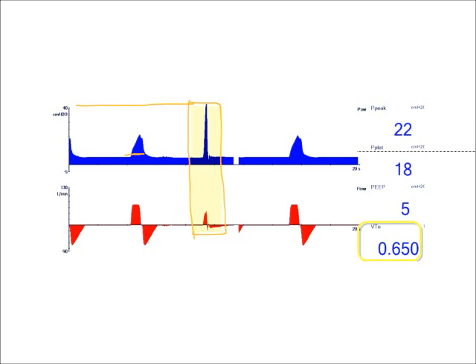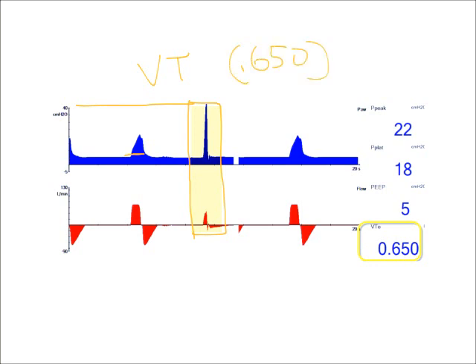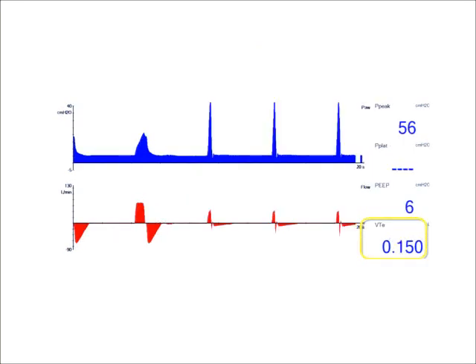Also highlighted in the bottom right corner is the exhale tidal volume. In this volume control ventilation we are targeting 650 mL, so the ventilator is set for 650 and delivering 650. With a series of coughs, the breath prematurely terminates, causing a dramatic drop in tidal volume. Since all the flow cannot be delivered and breaths are much shorter, I do not have adequate tidal volume delivery.